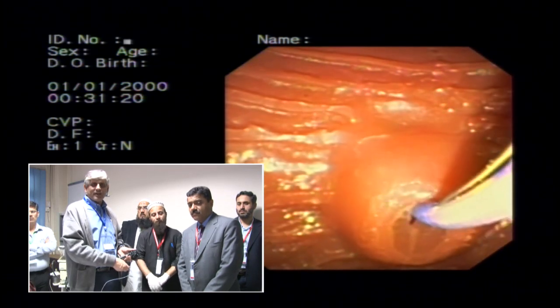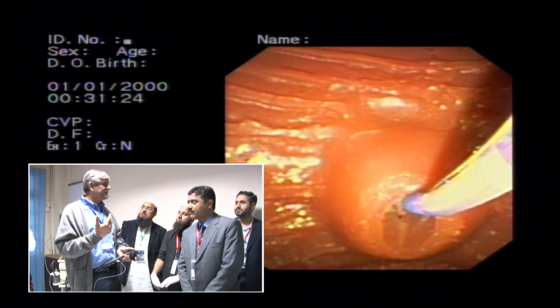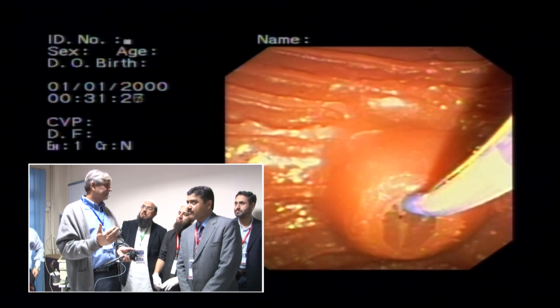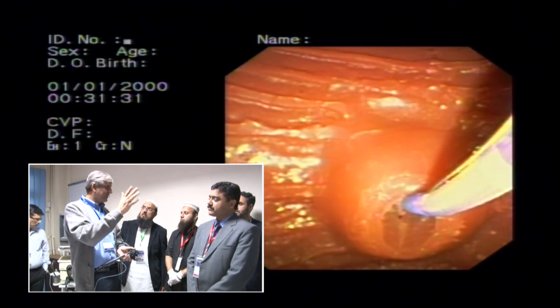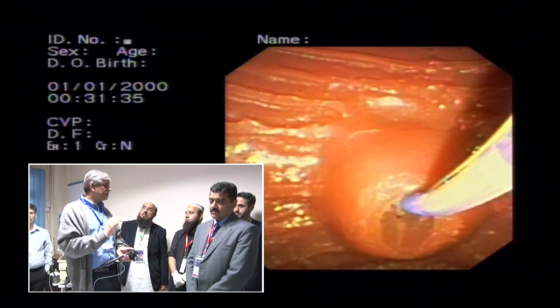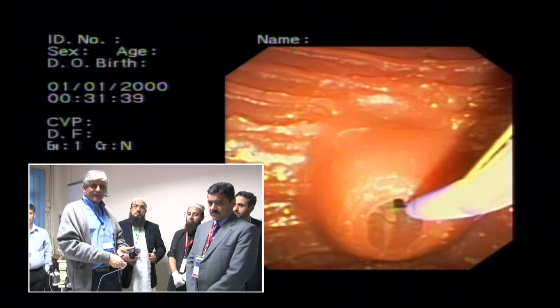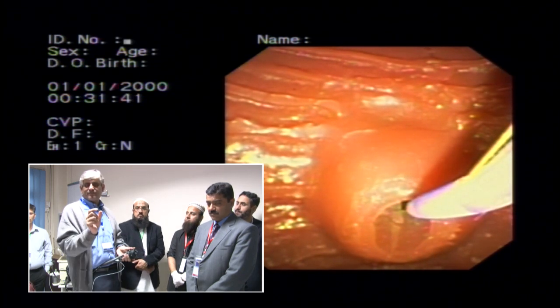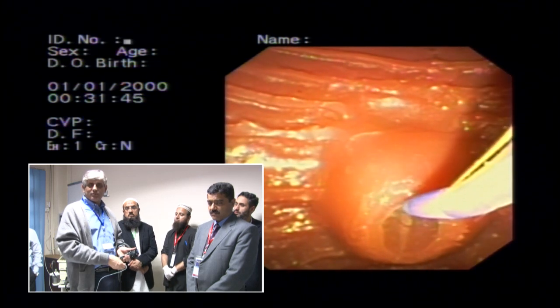Now what's the issue? The ones that I get stuck with are where you've got a CBD distally that's collapsed because there's a tumor above or it's post-op, whatever it is, it's completely collapsed below. So you just need to be patient. I think wire almost always gets you in. The wire technique you've already seen. A little bit of wire out, aim at where the CBD should be, and just gently put the wire in.